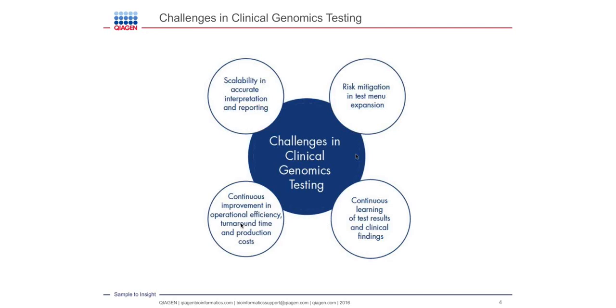And then the last one, and probably the most important from a human being perspective, is being able to continue learning on each of the cases and provide accurate clinical findings every single day. So if there is new information, new research, new drugs that are approved, or new clinical treatments that are now open, you want to be able to provide that. So you also have to balance your choice of supporting software in a way that you can continue learning about the specific case.